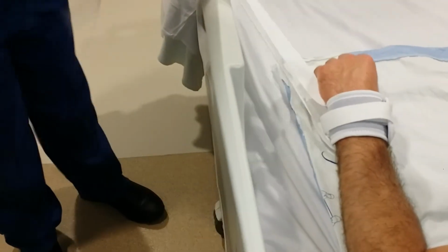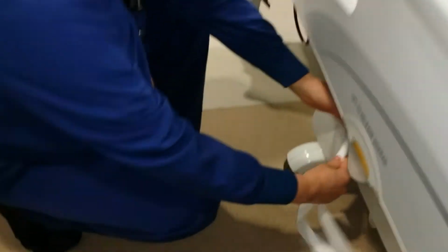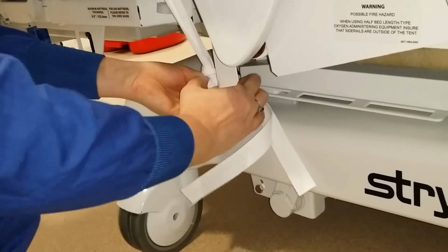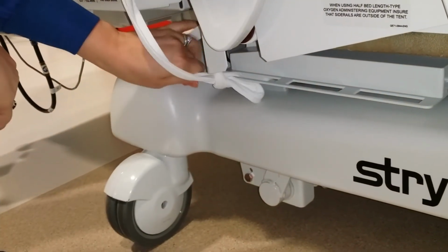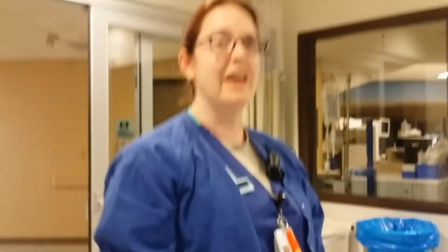In case of an emergency, when you tie your restraint, you need a quick release knot. So you want to make sure that you're tying somewhere on the bed that won't come off, and then you just do a quick release knot just like this. You can pull it here, it's not going anywhere, but in case of emergency, you pull here and it's easily released for patient safety. And that's what I can tell you about restraints. Please let us know if you have any questions, and make sure that the priority is patient safety and your safety.